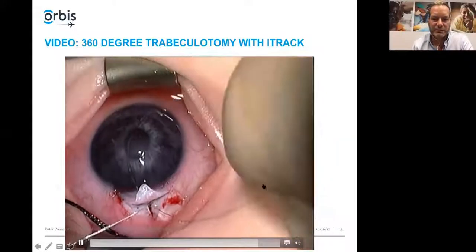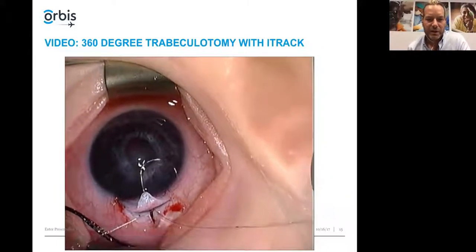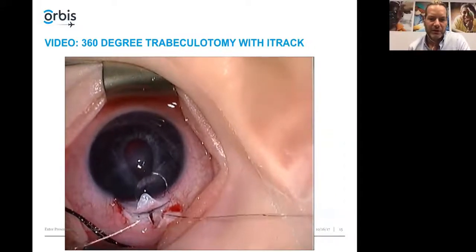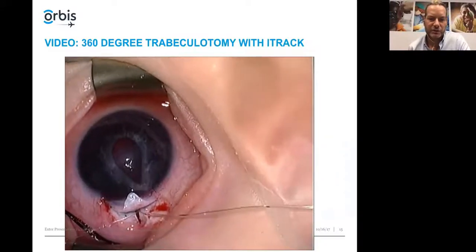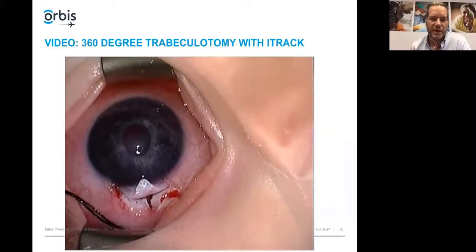And as I pull on the ends a little bit more, you can see the rest of the catheter coming out. Just make sure you don't get hung up on the iris right here. Just go slow, and it usually will flop out. If it doesn't, you can just let go of one end of the catheter and it will slide out. So that has some real nice advantages.